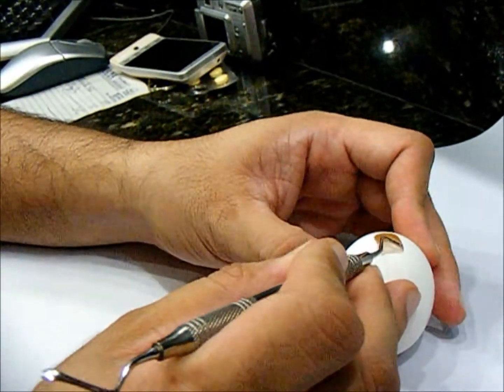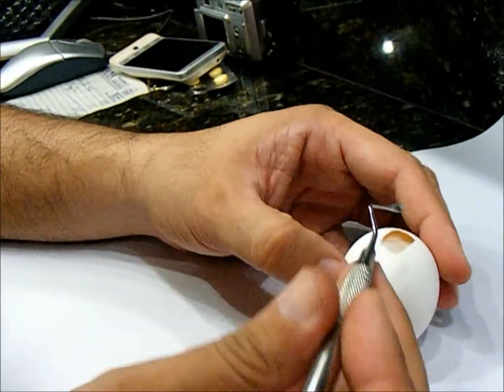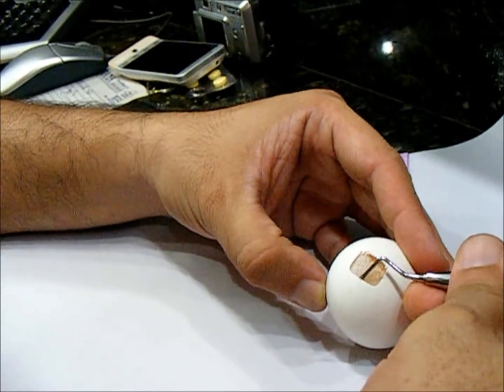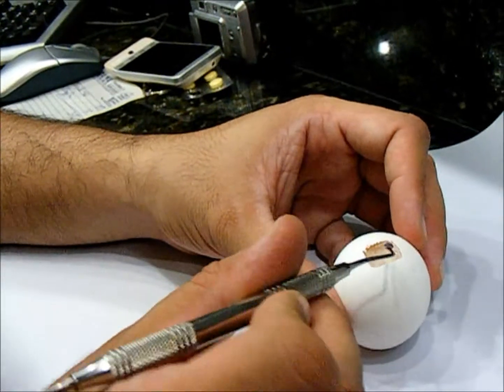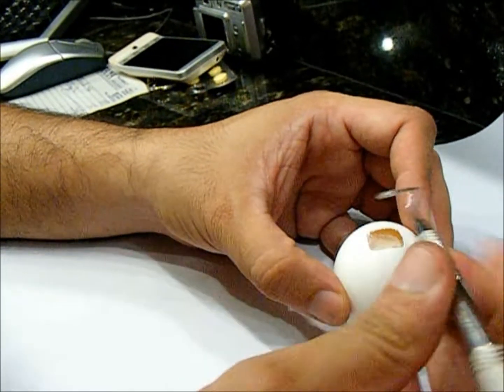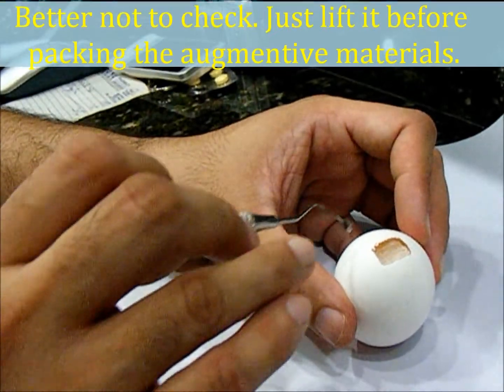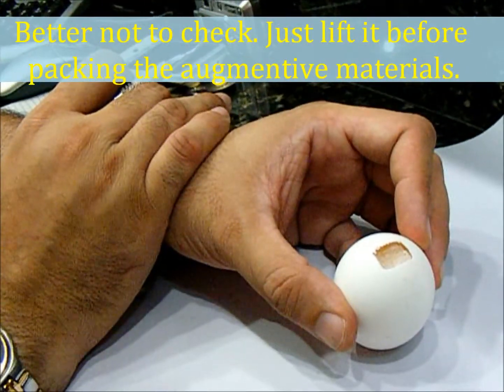This further proves that as long as you keep this slow movement — here I am rotating the egg, but inside the mouth you will be rotating your hand — as long as you keep doing it, you can lift as much of a sinus as you want. Never check the sinus with the flat end. Any time you want to check the sinus, check it with the back, rounded end of the instrument. This way, within minutes you will be able to peel a large amount of sinus back.